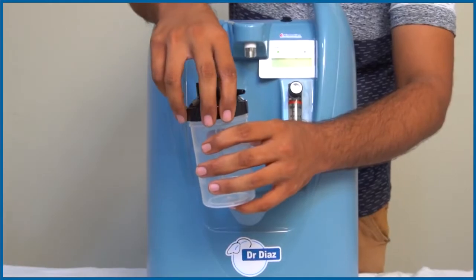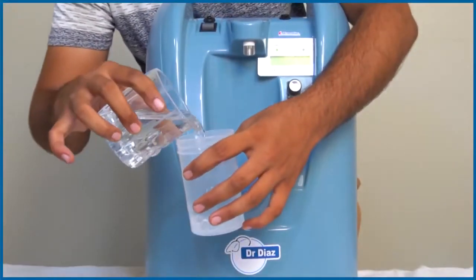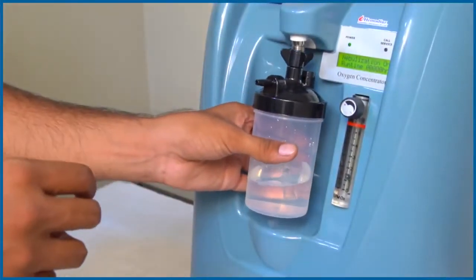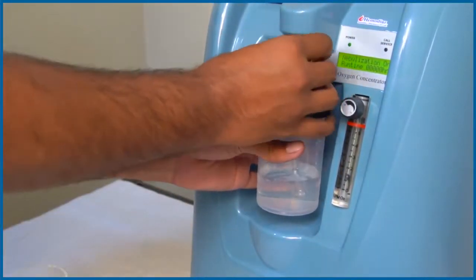Take the humidifier bottle, fill it with clean water, and keep the water level in between the minimum and maximum marks on the bottle. Fix the knob to get the humidified oxygen through the nozzle for the patient.